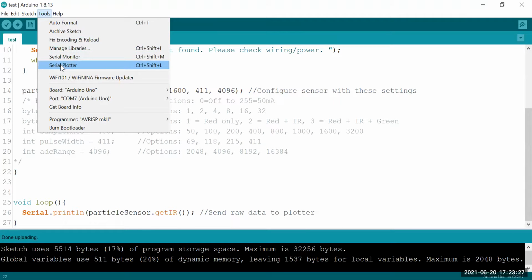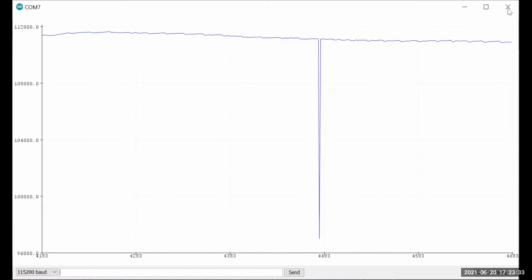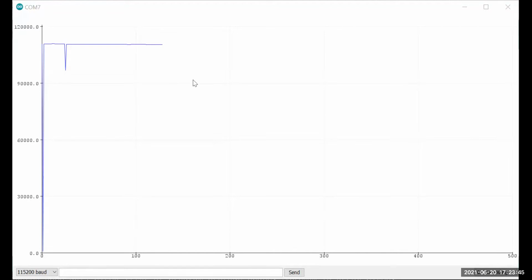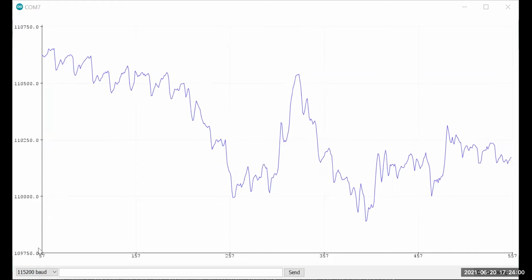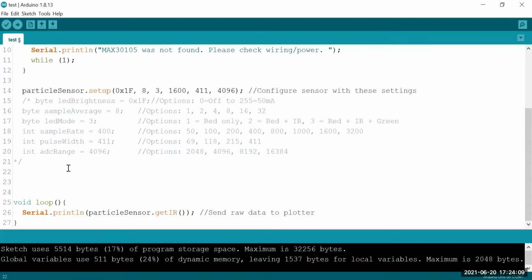Let me show you why we really needed that code in there. So let me exit out, let me tools, serial plotter, new share, and look at what it did. So it measured 0 a couple times before the sensor populated. And now I have to wait forever before my 500 data values are taken. And then it'll start to auto scale. So that's why I put this code in here. So let me go back and show you that.